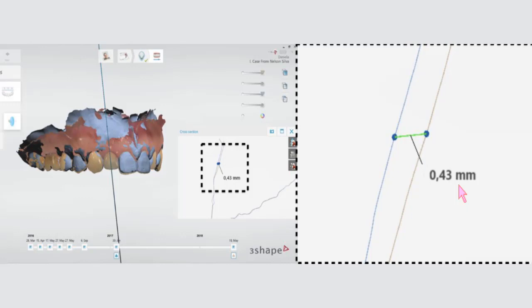So I start from scanning, and then I design to have a little sense of what I can offer to my patient. If the patient doesn't want to do any of this, I go and plan my implant. Or you can outsource all of this if you want to, depending on the business model that you have. And then I can scan and track my patient and really give him a little hint of what is happening. Every single patient would be very happy if you really show him what you have done and how the work you have done is performed.